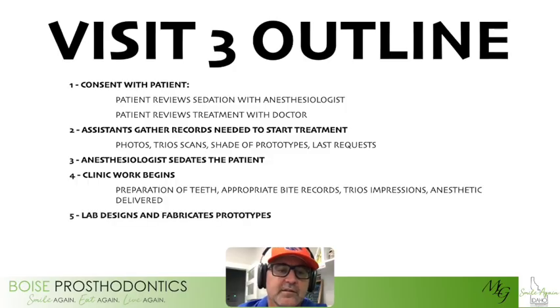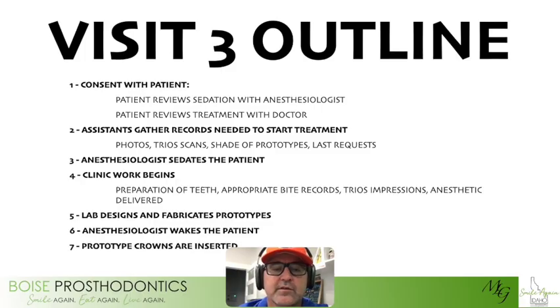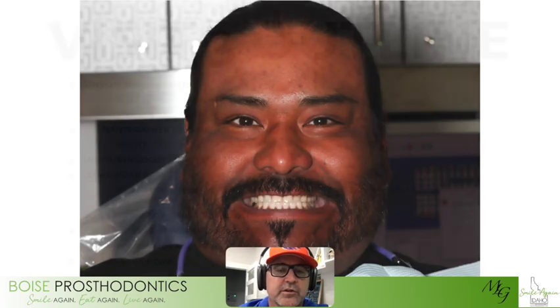Once that's done, the lab starts designing those prototypes and fabricating them. Our patient starts to wake up and rests in our office, being observed the whole time, and then we're able to deliver those crowns when they're completed and the patient goes home. So let me just walk you through some pictures of that process.